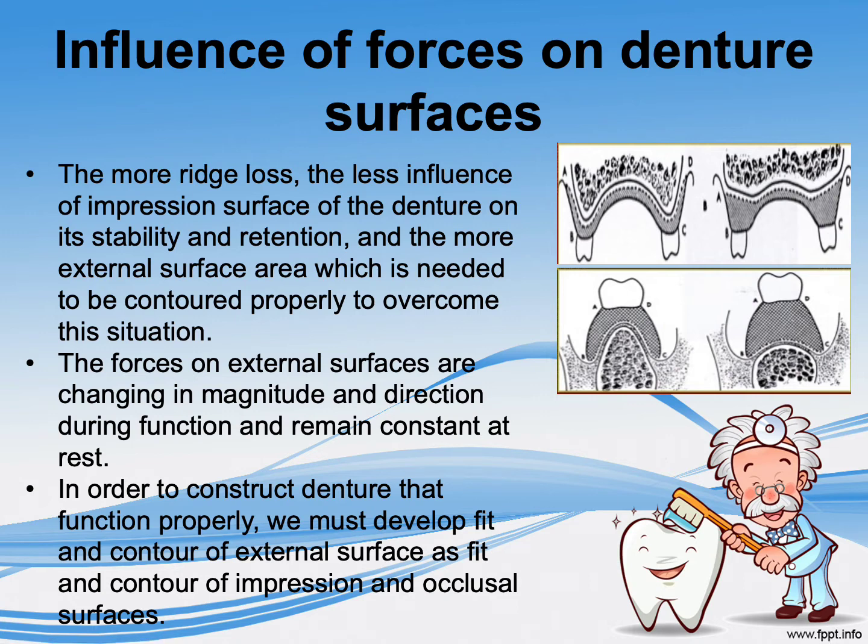The forces on external surfaces change in magnitude and direction during function and remain constant at rest. In order to construct a denture that functions properly, we must develop the fit and contour of external surfaces as we do the fit and contour of impression and occlusal surfaces.